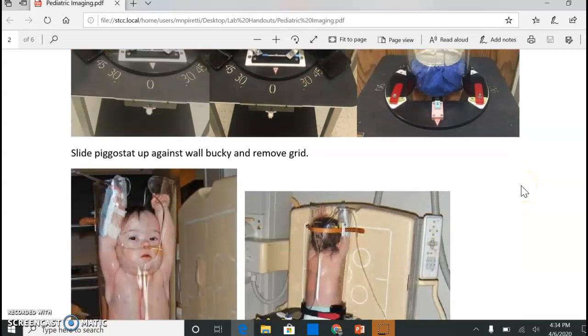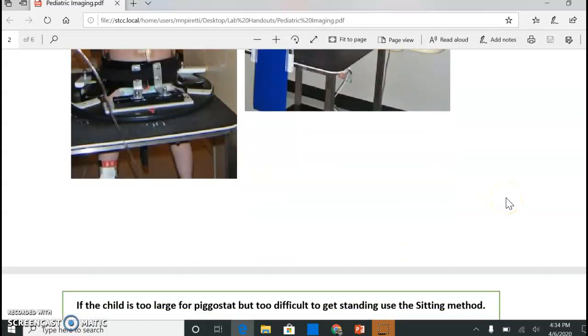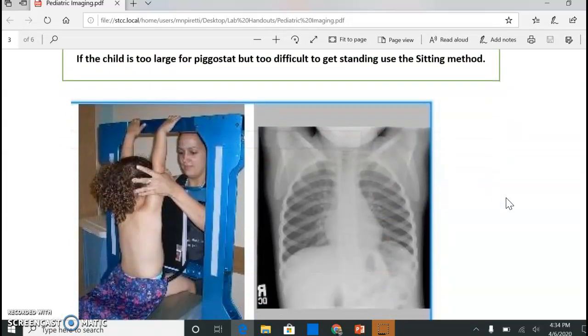Always have the parent with them. You're going to slide that Pigstat straight up against the wall bucky. The lead shield pieces can be raised up right behind them, or you can use those small square ones on the counters in all the rooms. This gives you your PA view. The circle on top lets you slide the child around into a lateral position without taking them out. If they're too big for the Pigstat but you don't think they'll stand and stay put, you can use what we call the sitting method — they'll sit on the end of the table.